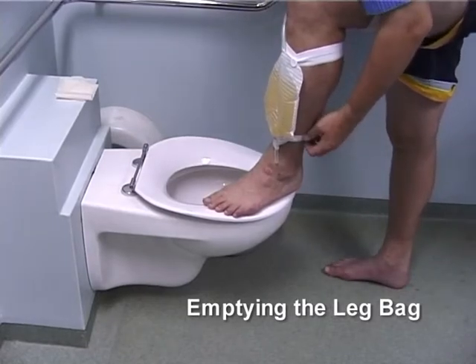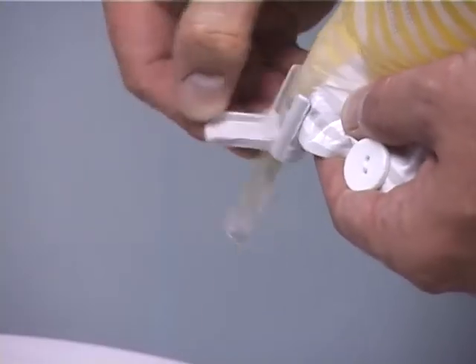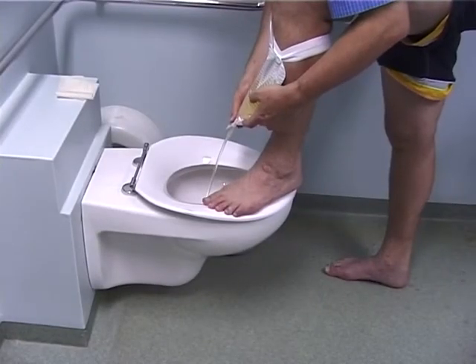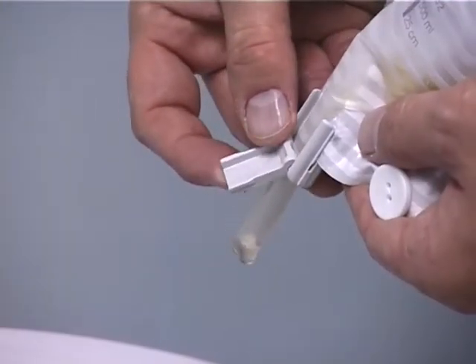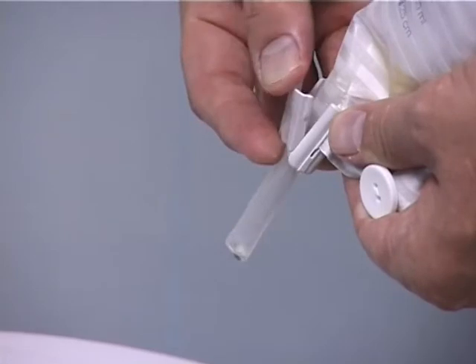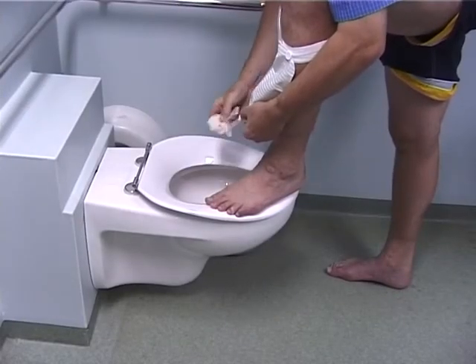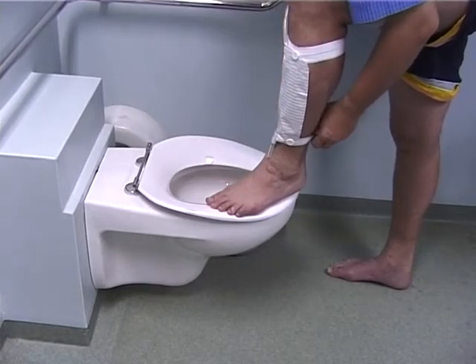Detach the leg bag from the leg and stand over the toilet. Release the clamp and drain out all the urine. When the leg bag is empty, close off the tap and give a little shake and wipe the end of the outlet with toilet paper. Then reattach the leg bag to the leg.